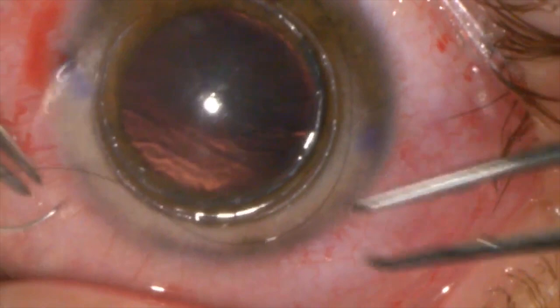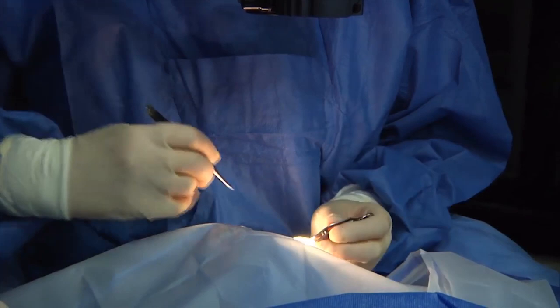The stitches. Normally we're going to put the first stitch in the center of the resection. Exactly. 90% of the depth. Yes.